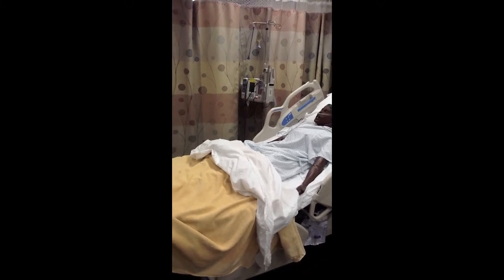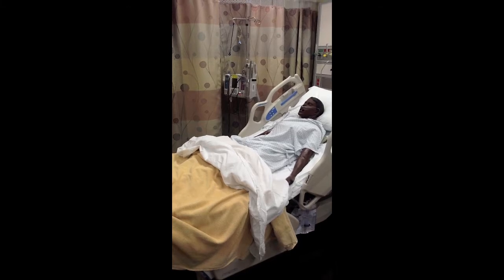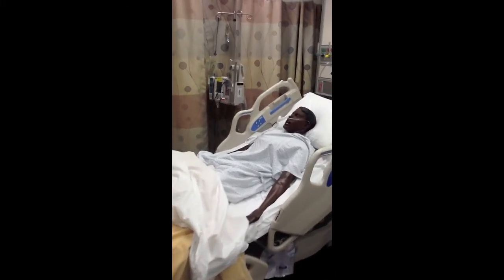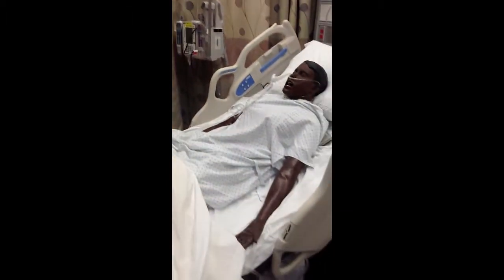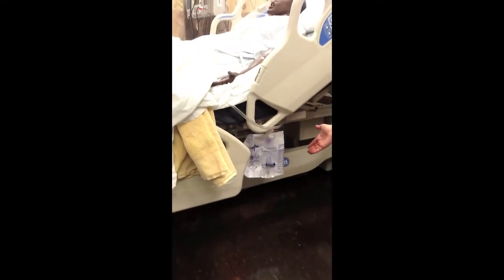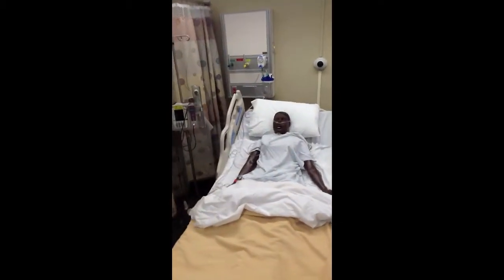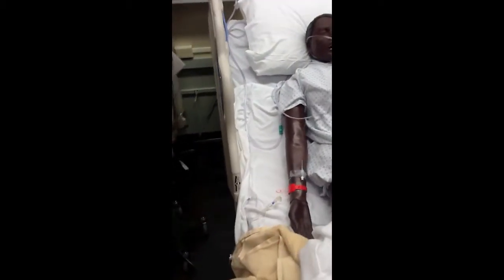This video will teach you how to ambulate successfully with tethers. A tether is any line or machine attached to the patient. Some examples of this are oxygen tubing, which is usually in the patient's nose, a Foley catheter, which is usually down low beneath the bed, or an IV pump, which is a long pole that usually administers medication to the patient. Other examples could be EKG leads or feeding tubes.